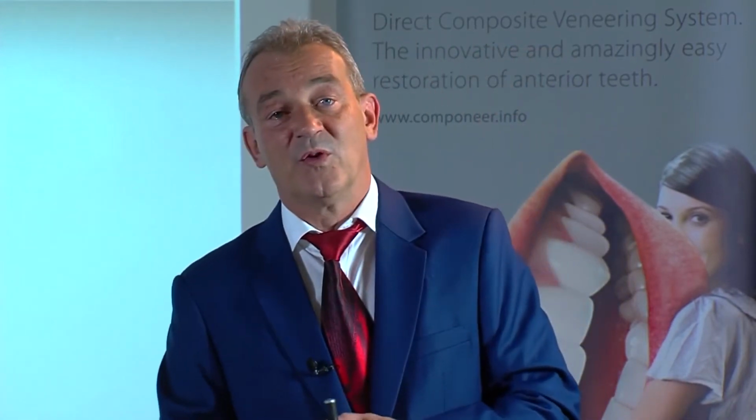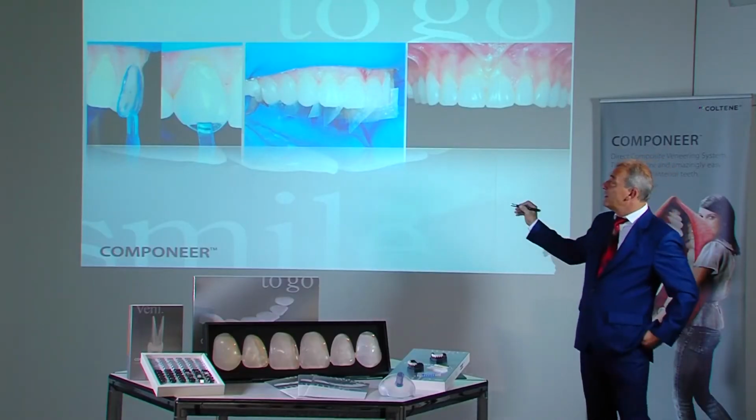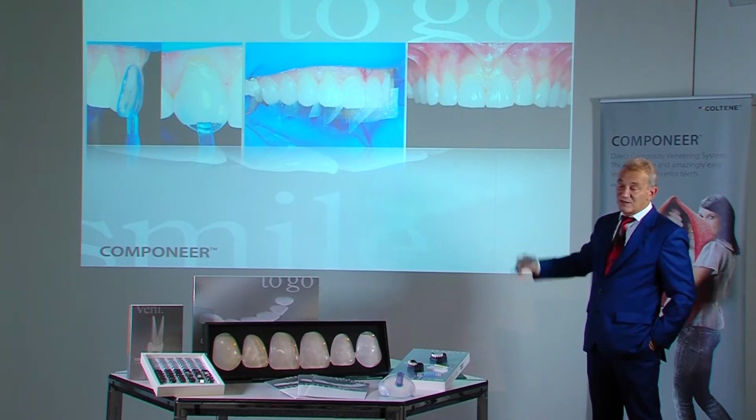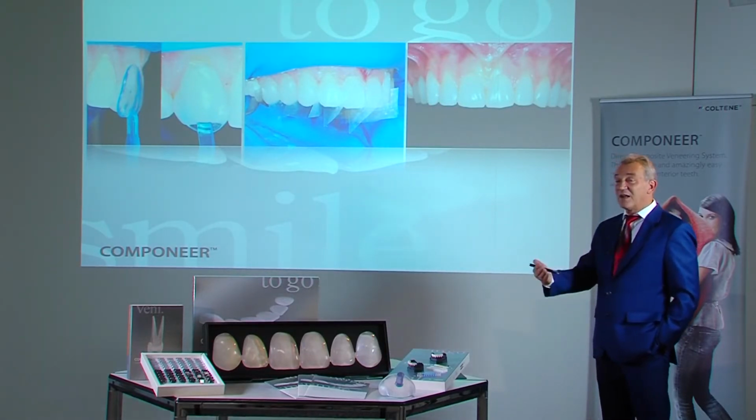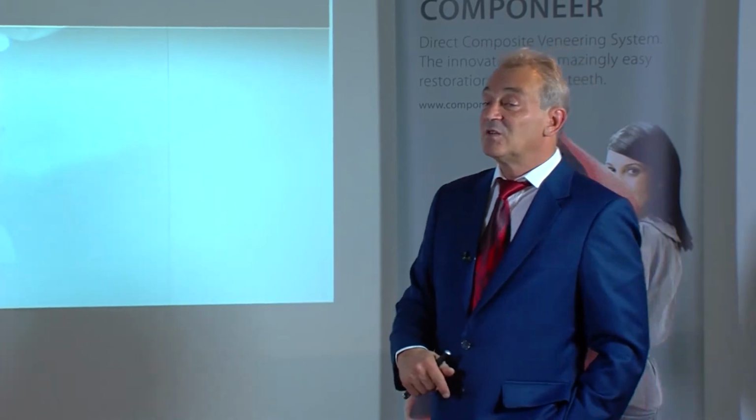In the case of erosions in the cervical region, it sometimes happens that the Componeer length is not sufficient. As already mentioned, the Componeers have ideal proportions in terms of length and width. And in the case of tooth neck defects, these ideal proportions are, of course, too short. There are two options to counteract this. If they are larger or represent real defects, one can first fill the cervical defects. Or they can be covered simultaneously with the Componeer if using the same material.